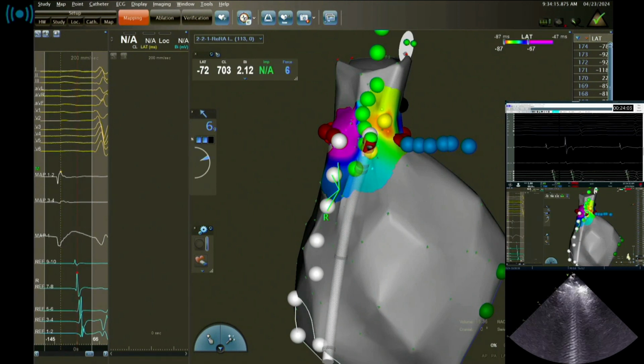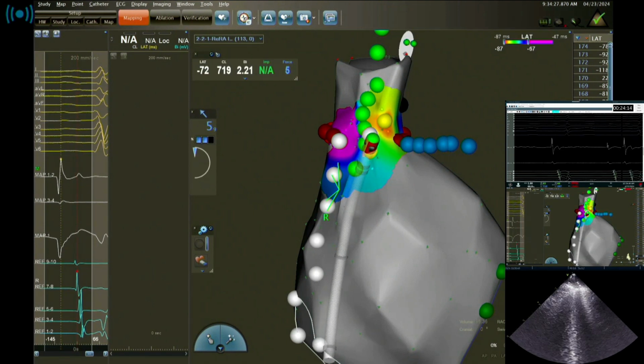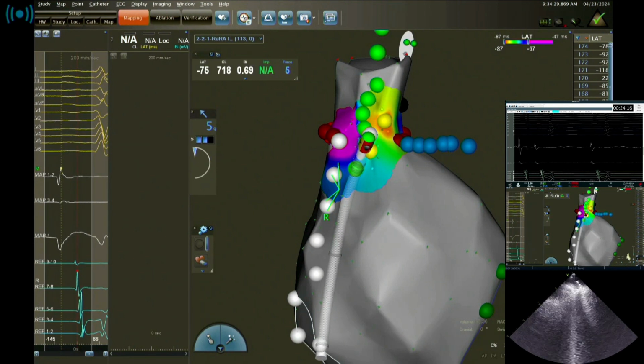So please. And one more thing, you have heard from Peter Peichler that there is an issue with these proximal rings that are displayed when you see the shaft of the Navistar catheter, you see one ring. The one is close to the IVC, the second one is somewhere in the middle of the right atrium, and there is some leak of pulse field energy.